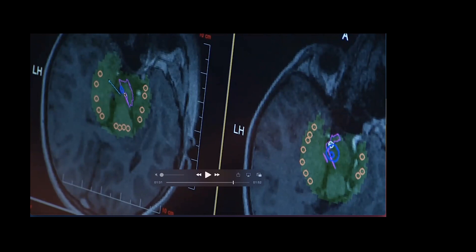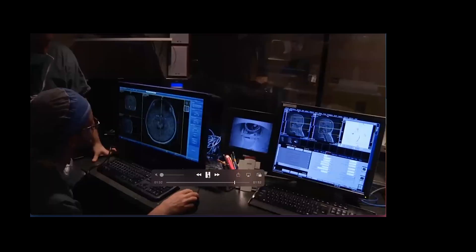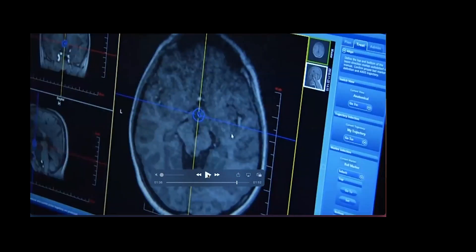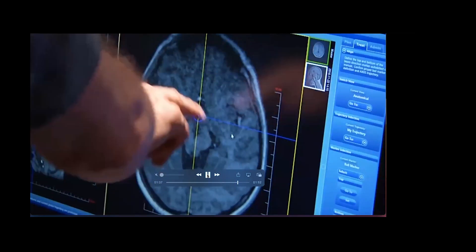What's important is I've traced out the optic pathway here that's in pale. Then I click to say what's the reversible damage estimate, and then it shows me that. So I go back and forth and look at the yellow. I know I'm causing thermal damage but it's not irreversible yet. I'm happy there because in this case I'm treating what I want to treat, but I'm encroaching the optic pathway so I'm going to be careful. Then I click the setting to show myself the irreversible damage. That's an estimate, right? So then you might say, well how do I see what I'm actually causing in terms of damage? T1 gadolinium enhanced MR scan will show ring enhancing gadolinium ring enhancing lesion that will delimit the outer border of what you've ablated. During an ablation and certainly after, I will get a T1 with gadolinium. So I'll do a half dose gad injection and that will show me the area of ablation.